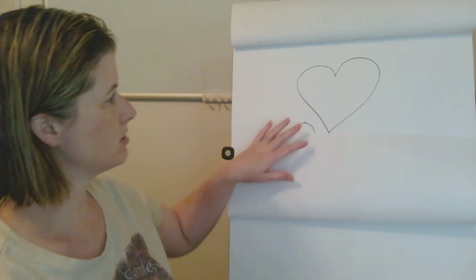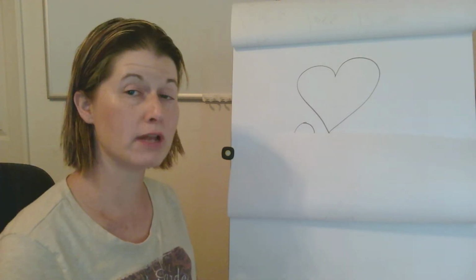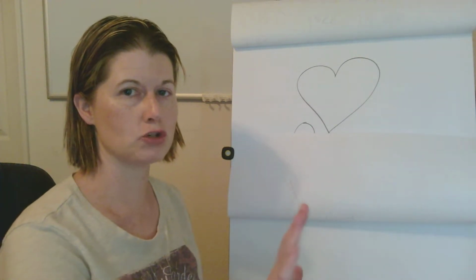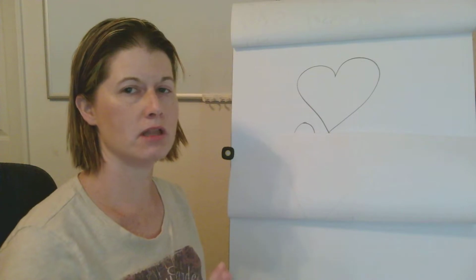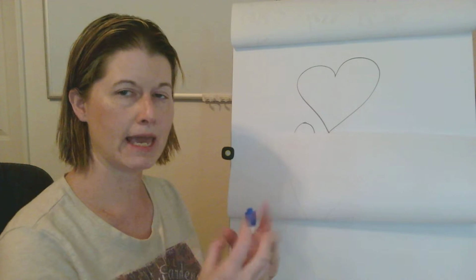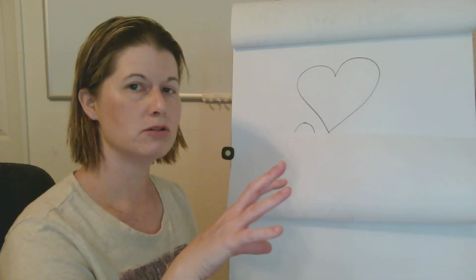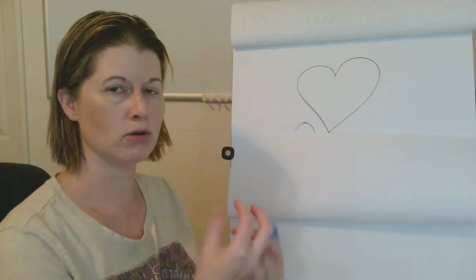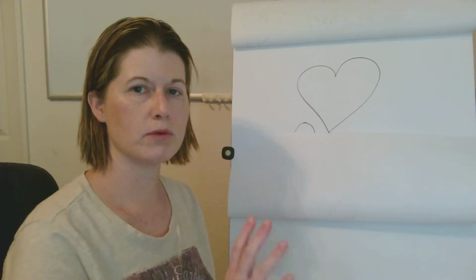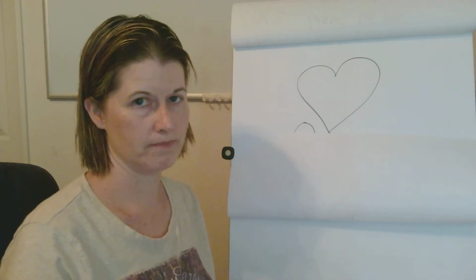So we have the heart, and the EKG is, as we know, just a way to measure electrical activity of the heart. Remember that it's just electricity, so what you see on the monitor is just telling us how the electrical system is working in the heart. It does not mean that there is a mechanical response. So what we are looking for is electricity shocking the heart, stimulating a contraction. The only way we know that there's a contraction is to feel for a pulse and look at our patient. So when we talk about EKGs, you always have to have that in the back of your mind that we're just looking at electricity. Okay?